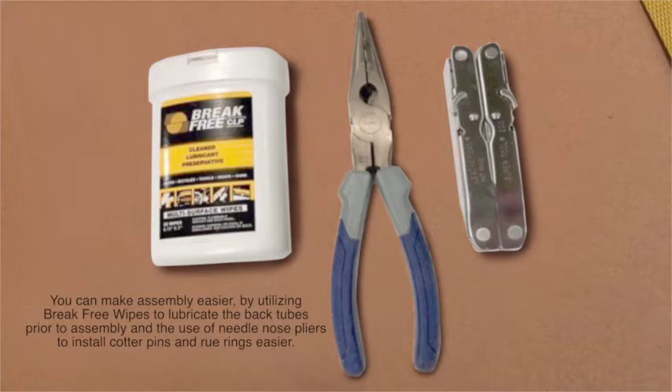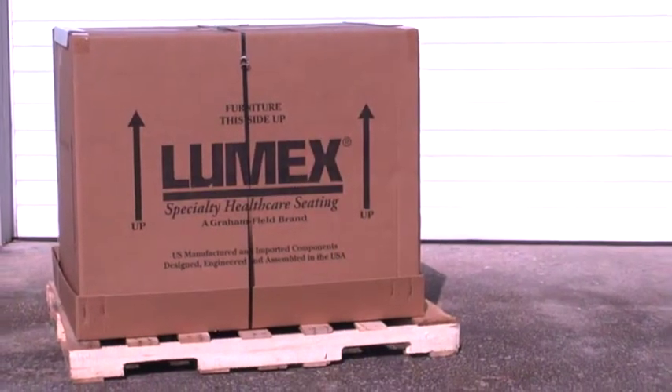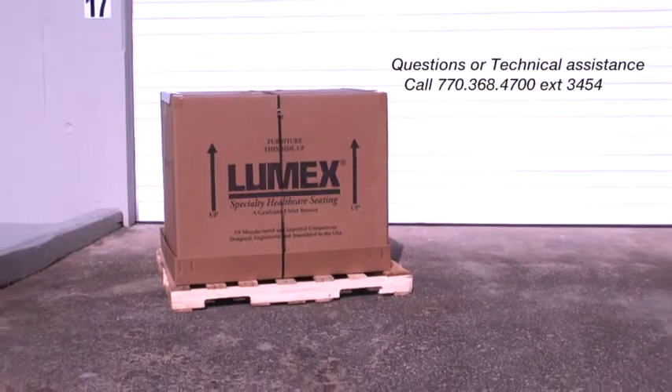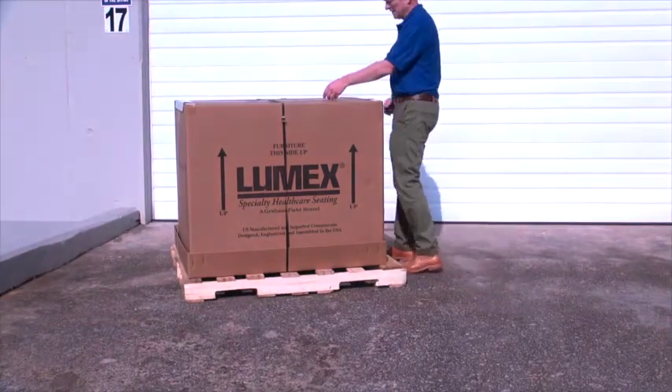Your Lumex recliner will arrive strapped to a pallet. Check for obvious damage to the carton or its contents. If damage is evident, please notify the carrier and Graham Field. Using a multi-tool or needle nose pliers, cut the straps holding the carton to the pallet.